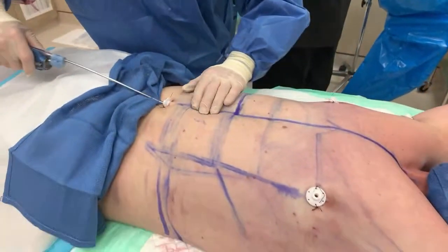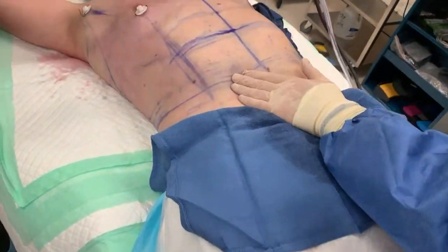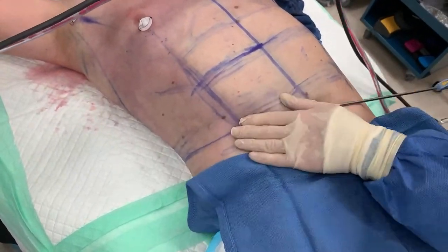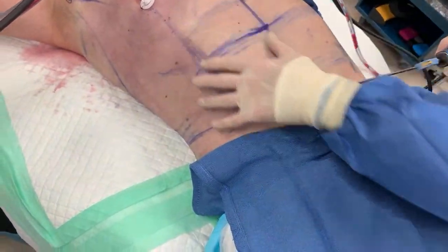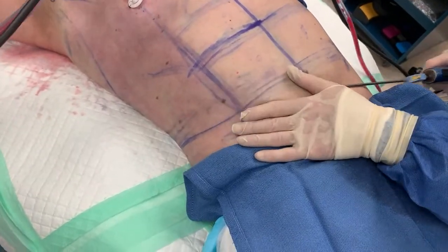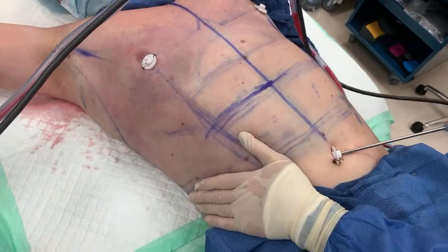Alright, so we stopped at 12 — it's 1,500 per side. So on the nipple side I got 12. What's 15 minus 12? So if you go to 17 and then 22, you'll be even. I just want to make sure that I go this side and get the same amount. But I've already done this, so it's not easy.